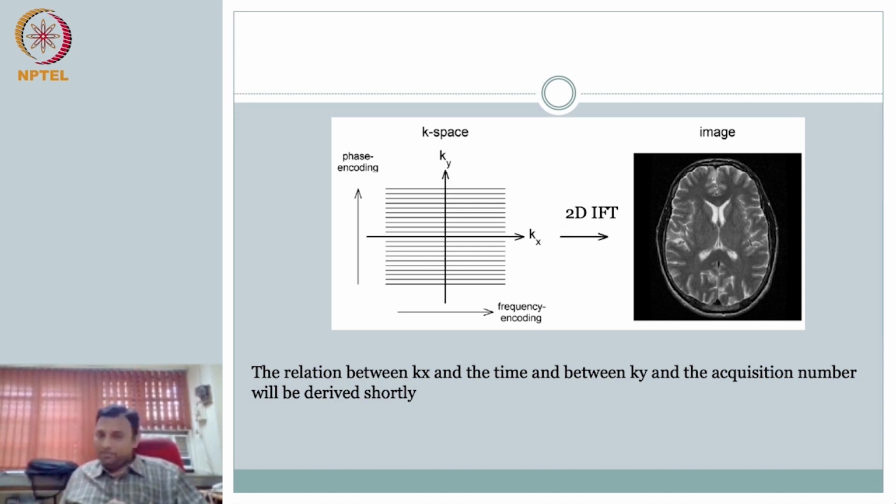But such is the beauty of MRI that you can do several things, but to get this basic feel for what is this gray, what is this black, what does this mean, is not straightforward. I hope you repeat the physics lectures and then the data acquisition lectures and get a feel for it, because the reconstruction lecture is straightforward. If you understand this, taking the inverse Fourier transform coming here should not be that difficult to understand.